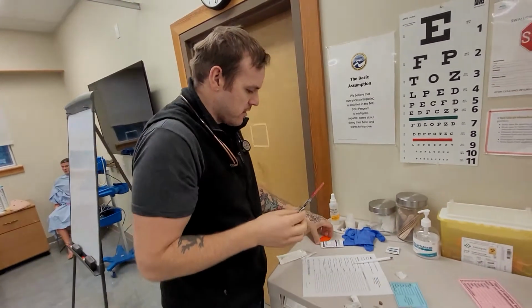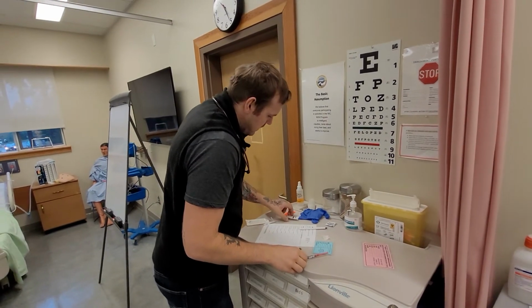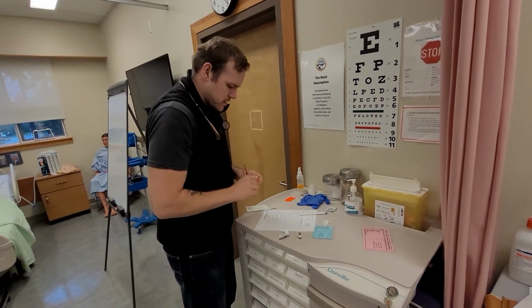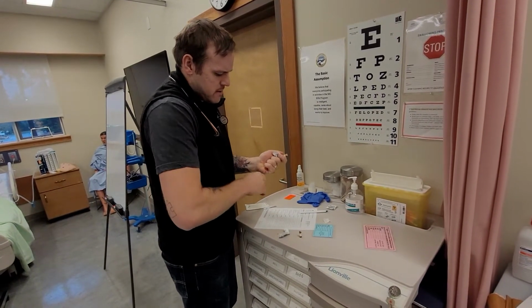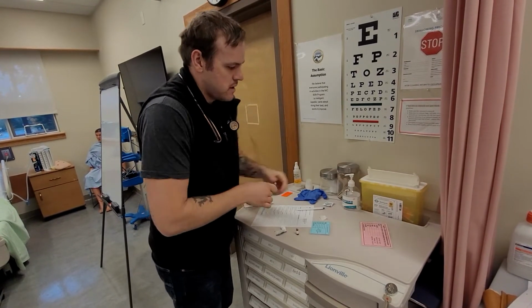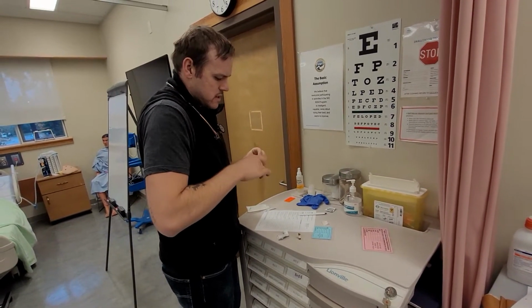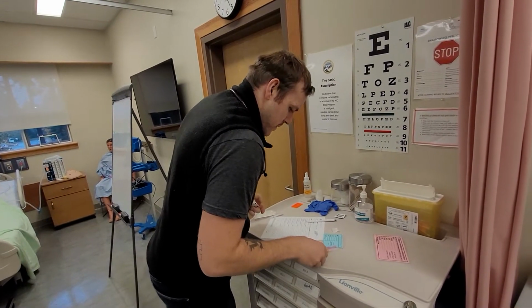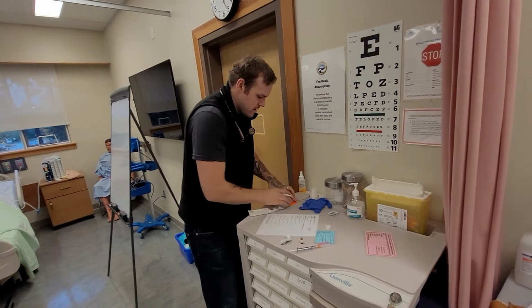Now we're going to fill out our medication label. We're just going to switch to the injection needle here first, making sure not to touch the ends. We've got our injection needle here, and we're going to fill out our medication label.